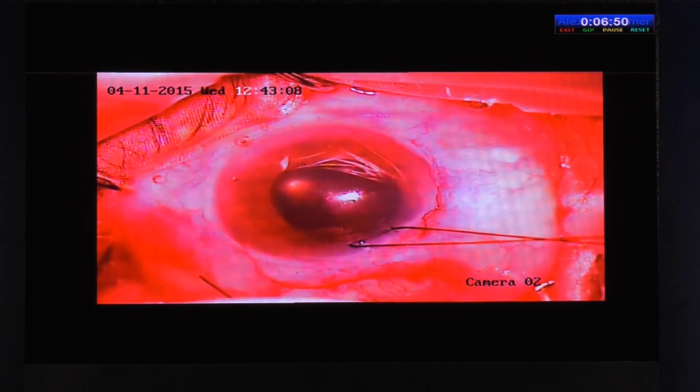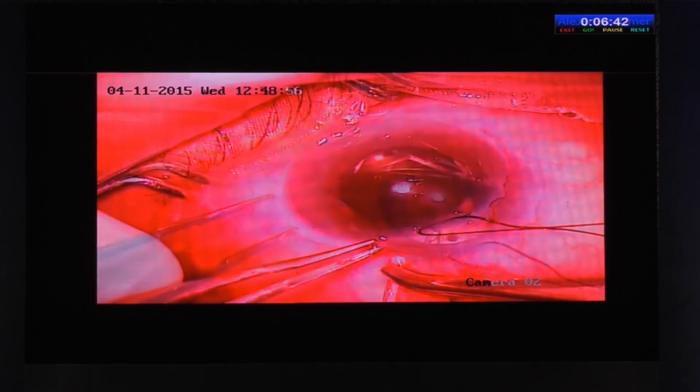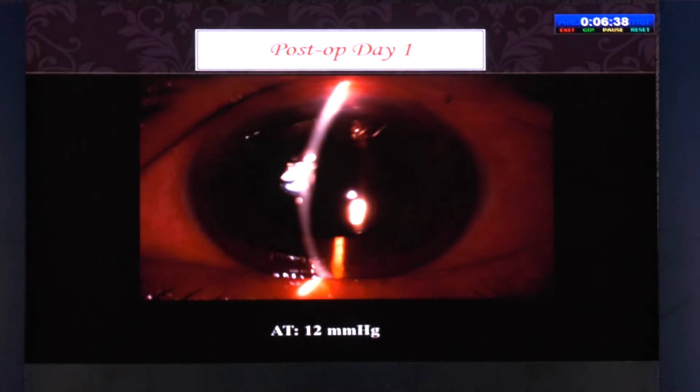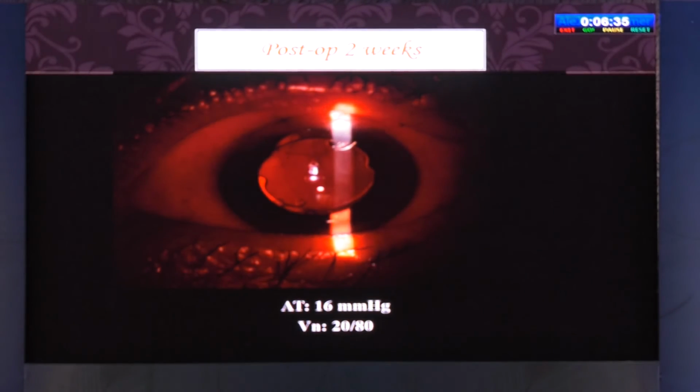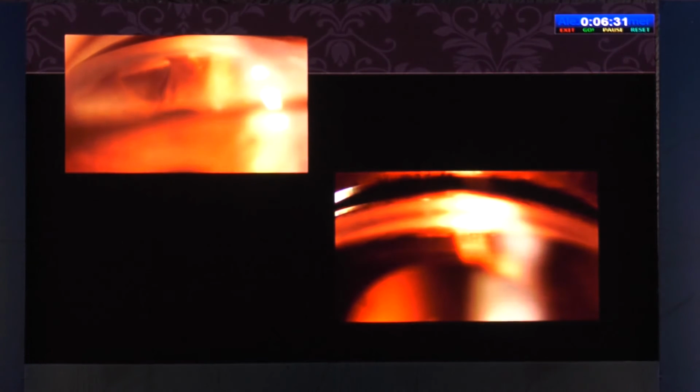This was the only difference, the entry at the sulcus, and you can see the tube sitting nicely at the sulcus. The pressure was maintained and the vision improved. There are other indications, as was mentioned, ICE syndrome and uveitic glaucomas, where it really helps.